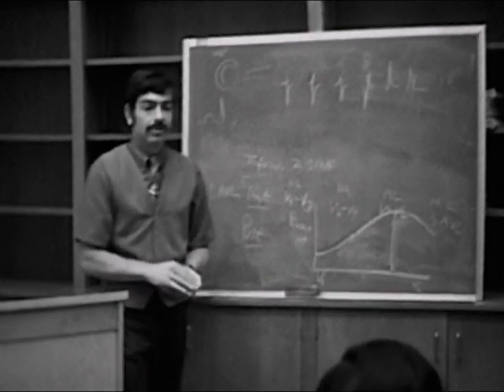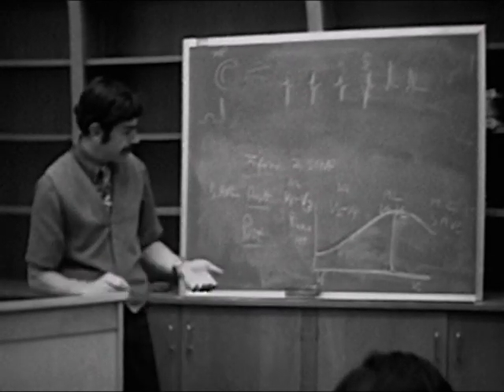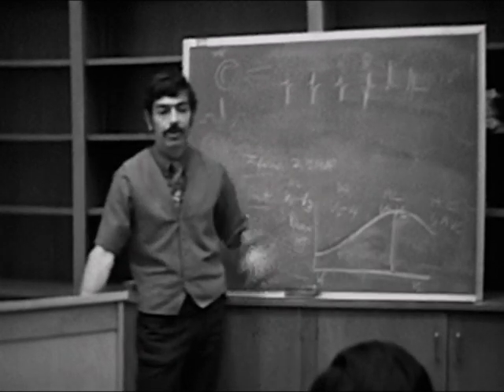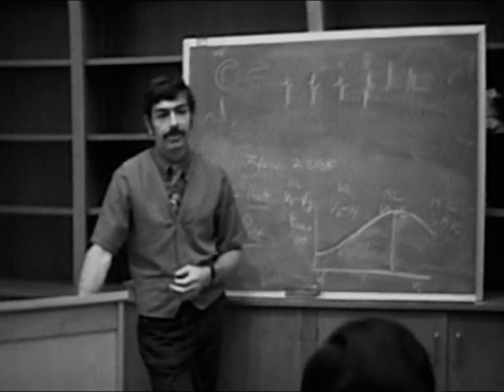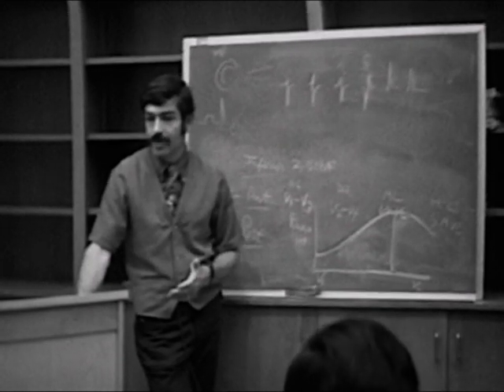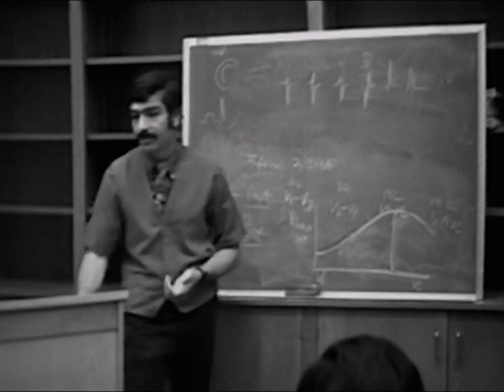All right, now maybe we should just stop here for a minute and stand back and say, well, so you have an infarct in 2, 3, and AVF. What coronary artery is involved? These are lesions of the right coronary. The right coronary, in most individuals, supplies the inferior surface of the heart in 85 to 90%.